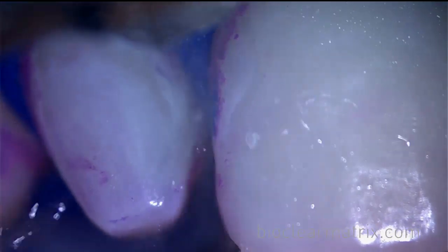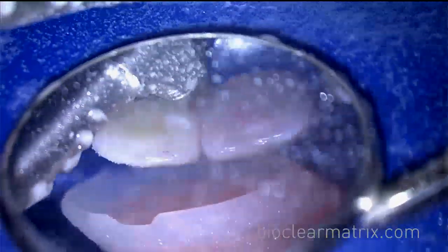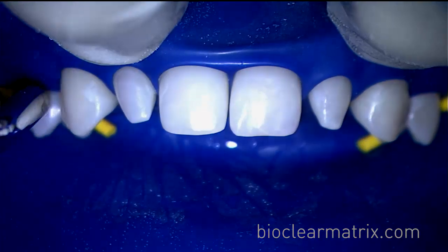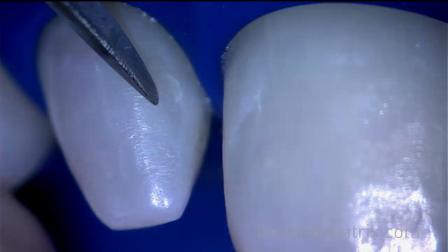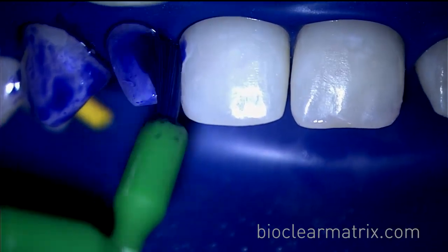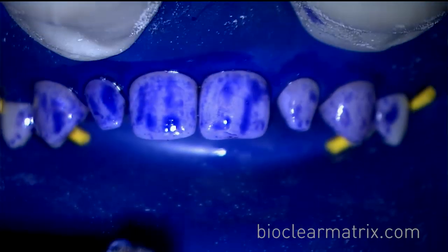Holding the blaster close to the tooth will allow for optimal biofilm removal. Sometimes, the use of a scaler is needed along with additional disclosing and blasting until all biofilm is removed.